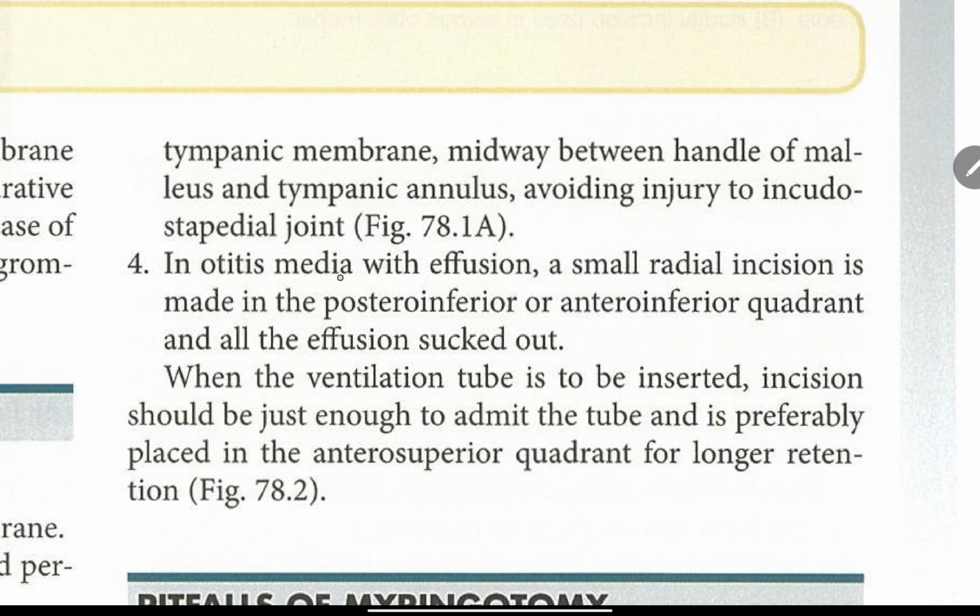4. In otitis media with effusion, a small radial incision is made in the posterior inferior or anterior inferior quadrant and all the effusion is sucked out. When the ventilation tube is to be inserted, incision should be just enough to admit the tube and is preferably placed in the anterior superior quadrant for long retention.